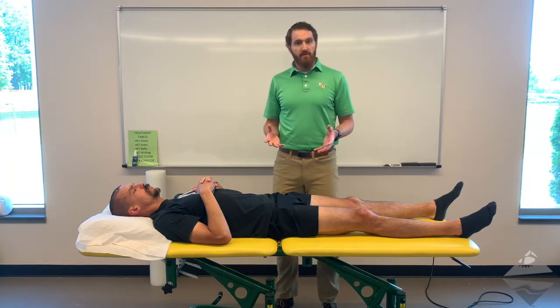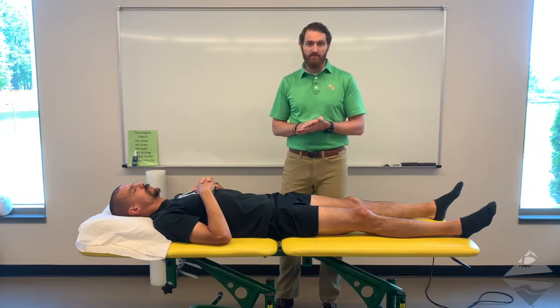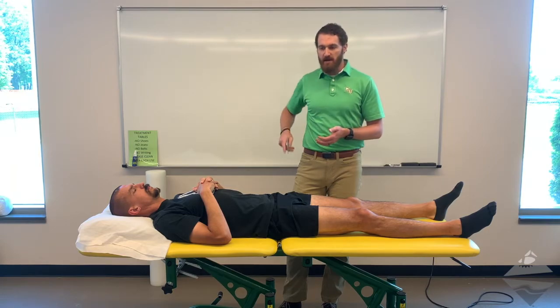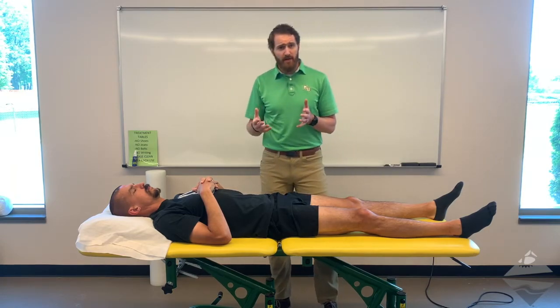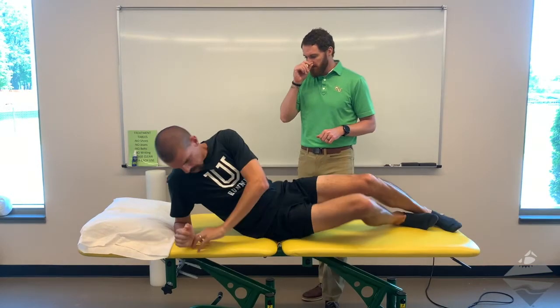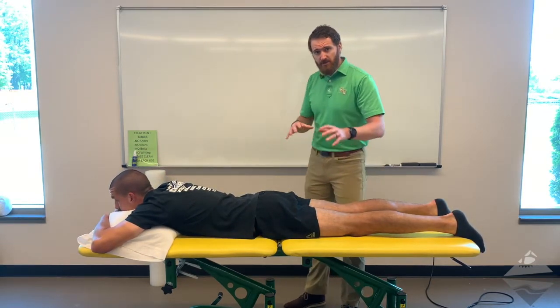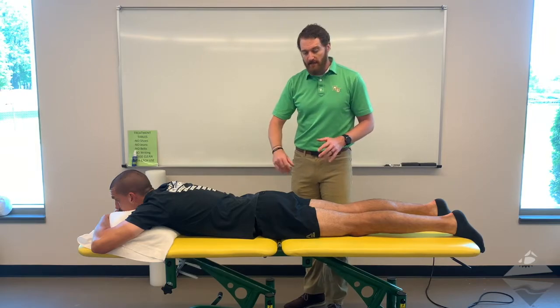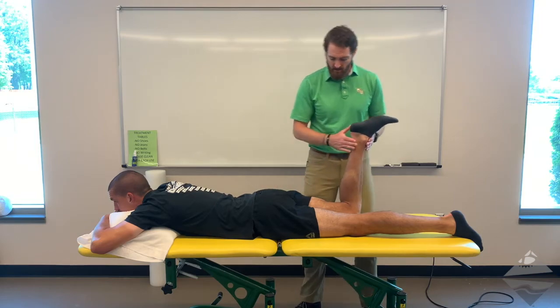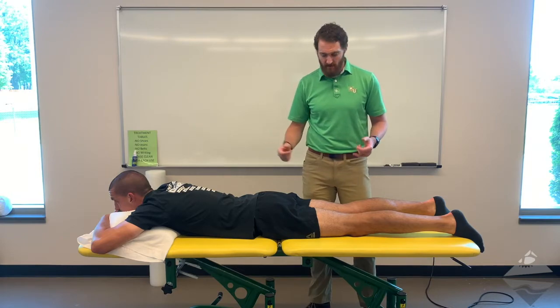The only motion remaining is extension. Hip extension is a challenging range of motion to measure with a goniometer simultaneously. There are two ways to approach this, and for this assessment we'll have the individual flip into a prone position. We started on the left side for visualization, but I'll now move to the right side. Hip extension can be assessed with the knee flexed or extended, keeping in mind the two-joint muscles and soft tissue involved.